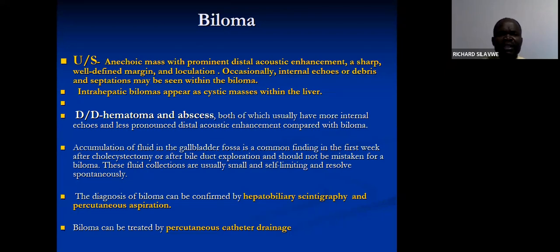Then intrahepatic bilomas appear as cystic masses within the liver. So the differential diagnosis for that can be hematoma or abscess, both of which usually have more internal echoes and less pronounced distal acoustic enhancement compared with the biloma.